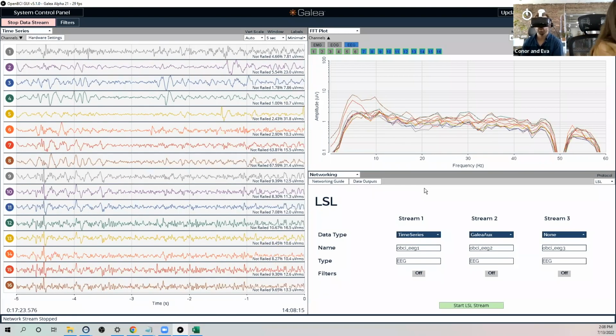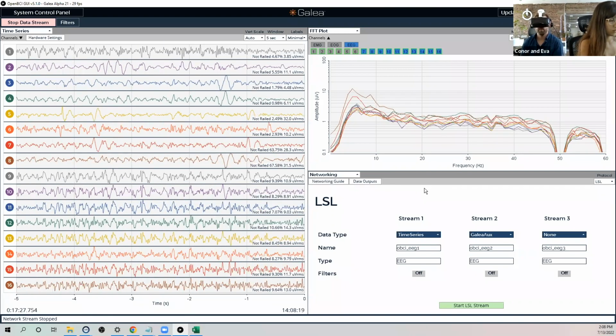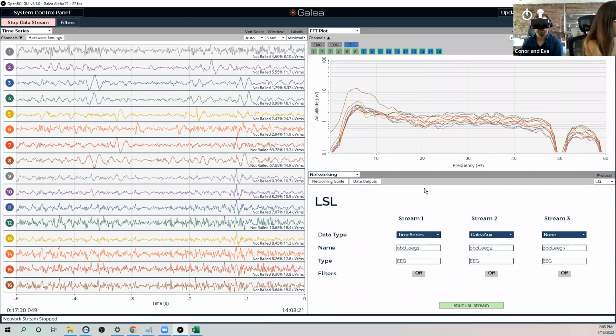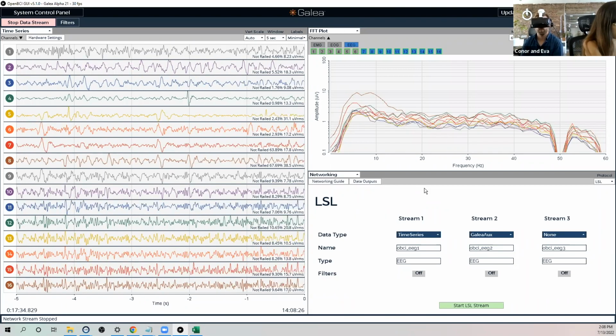The idea is that when we roll this out, we have some type of derivative metric generator that is based on scientific data that we collect internally, and maybe studies that we run with partners.